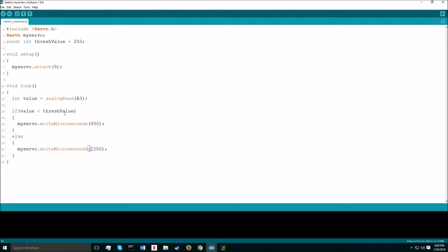For this thresh value, it varies from person to person. My thresh value was 250. With this program and the Myoware attached to your bicep, you'll be able to manipulate the servo by flexing your bicep.